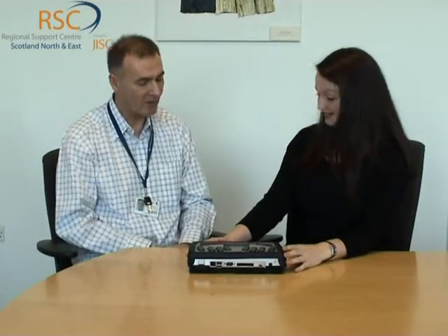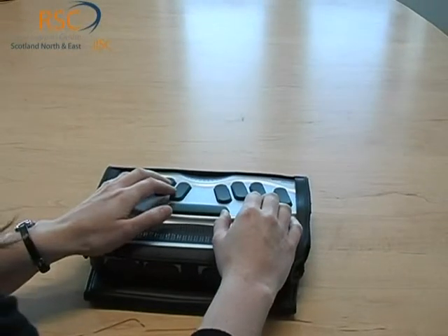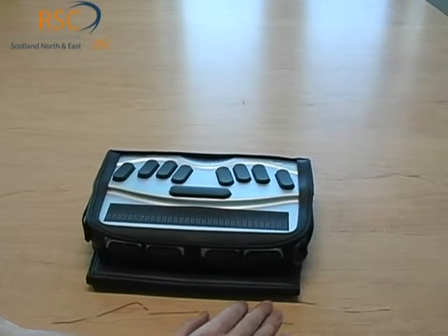Using a combination of these keys to type, the Braille comes up on the refreshable display here. This is a 32-cell display, and you have the option of getting it in an 18-cell if you choose. It's great for taking notes — especially in lectures — reading back your notes, reading books, or other documents on the Braille display, and you've also got speech output as well.